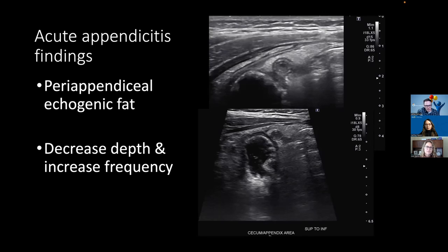Yeah, so we have Philips here in Colorado, and relatively recently we changed some of our presets in our machine. We've had similar experiences to what you're having now, with that fat looking more echogenic than I think it really is in reality.